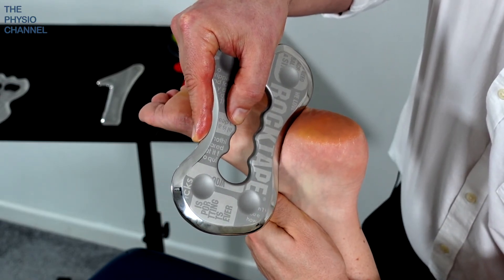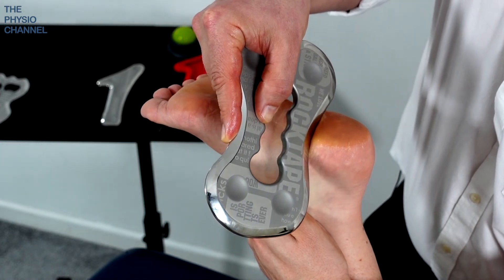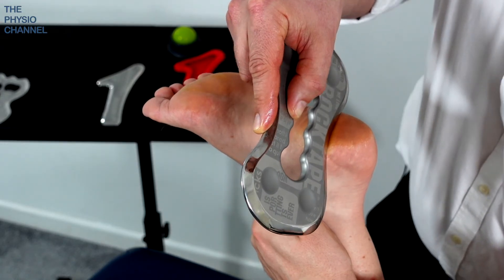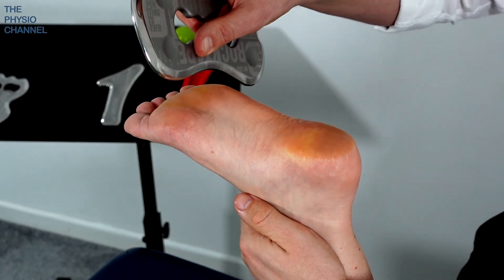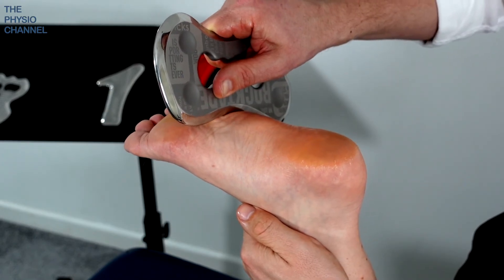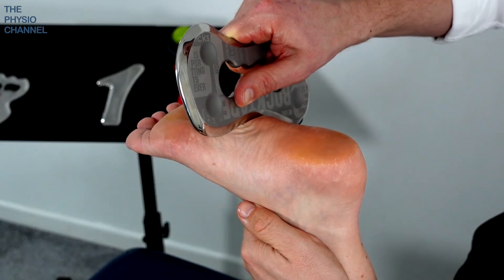All the way up to the underside of the calcaneus. And the third repetition is going to come down with more of a lateral bias over that lateral longitudinal arch of the foot.